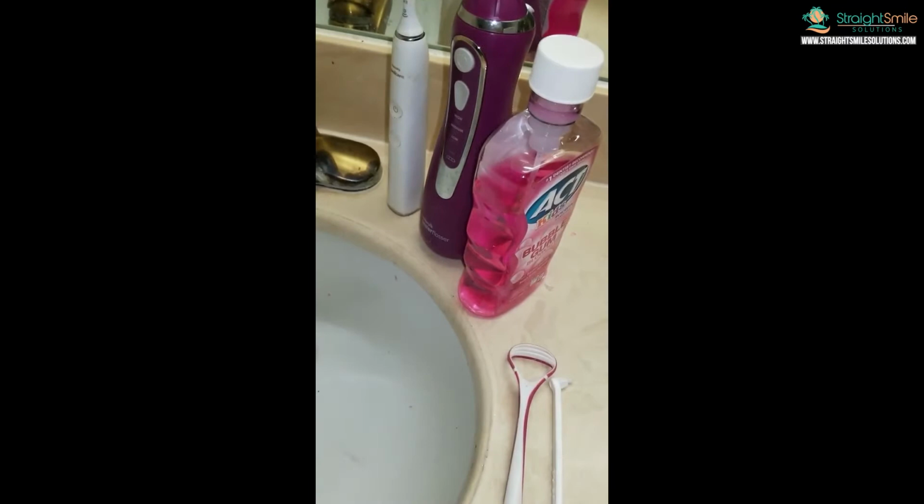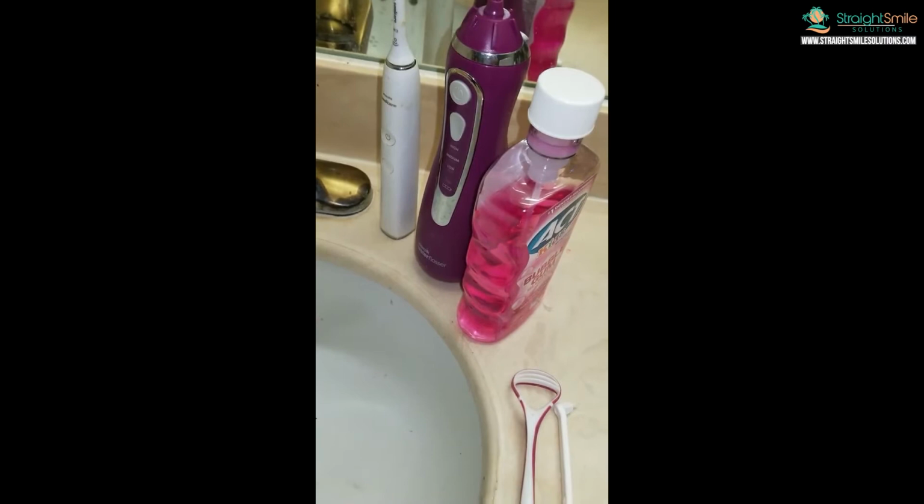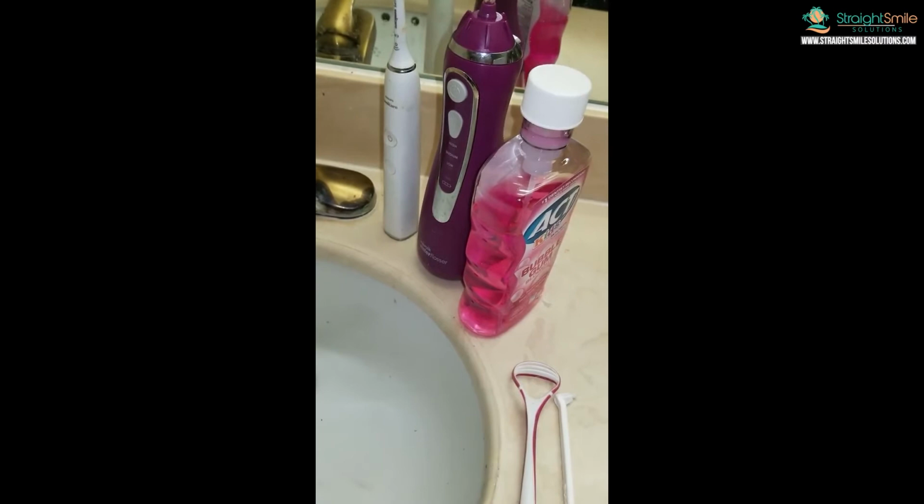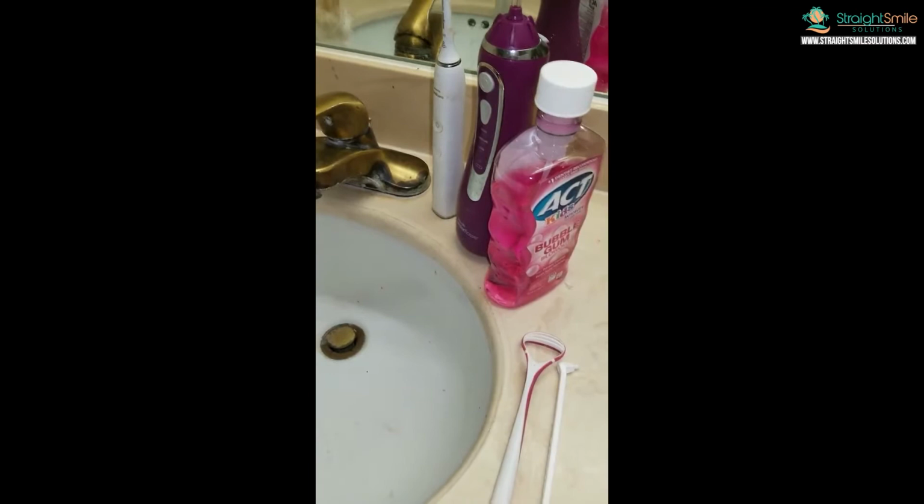It can be a little bit of an investment. The cool thing about the water pick is that you can exchange the tips. The same thing with the Sonicare. So you can share it with multiple people as long as you pull your brush head or your tip off. So it is an investment of a couple $100s, but you will have much healthier teeth afterwards and have better outcomes with your braces or aligner therapy. So in any case, hopefully that helps. These are things I would go buy before you start your ortho treatment.